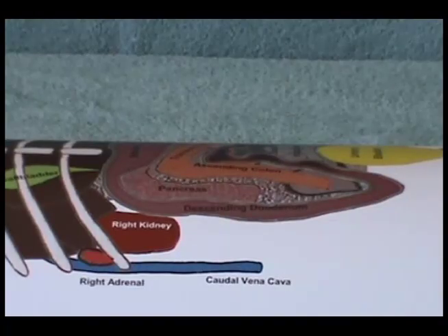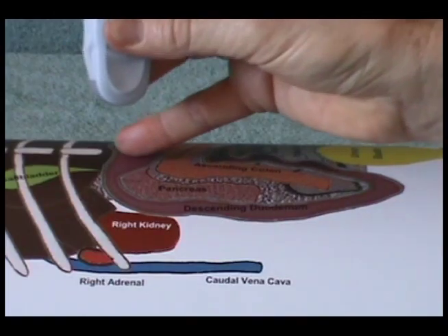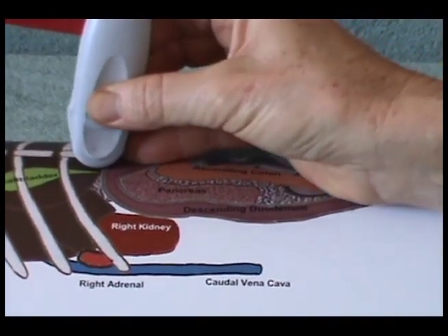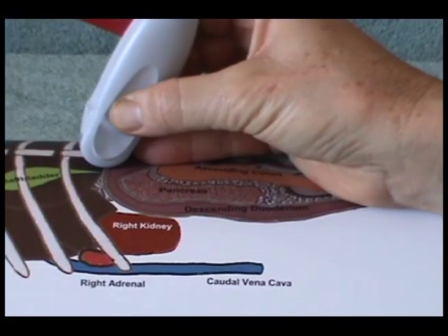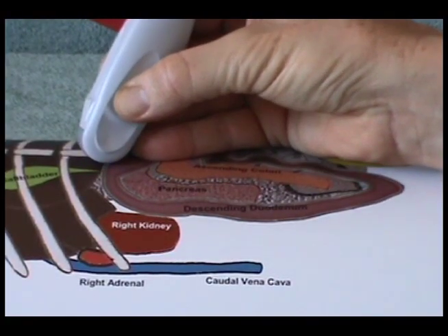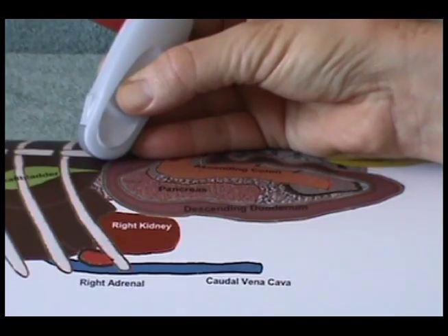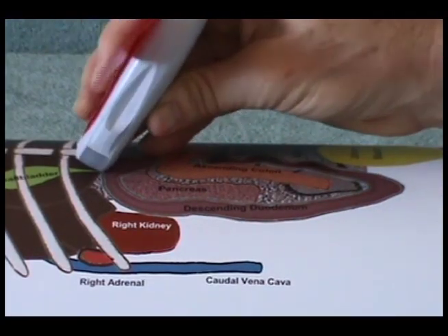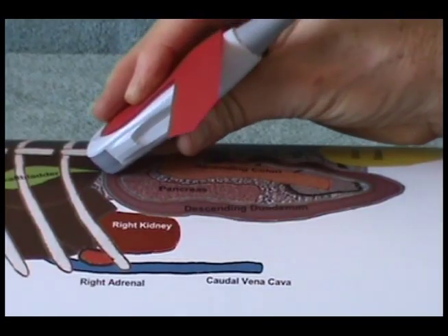Let's study the pattern of the abdominal exam as we go from one organ to another. We will concentrate on developing skills of the transducer hand. Use your canine abdominal graphic to copy my movements. Look at your transducer hand as we do the scan.